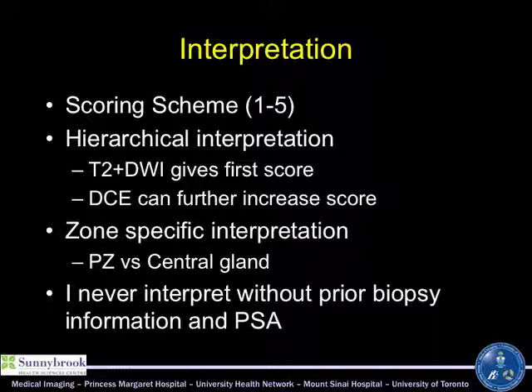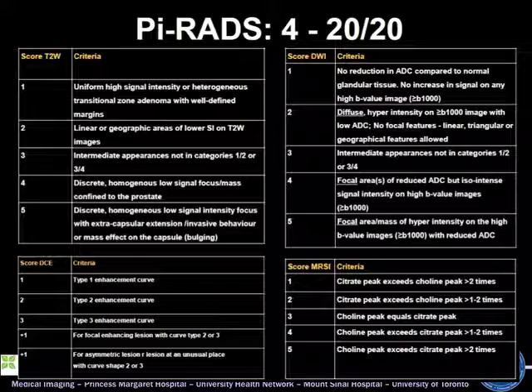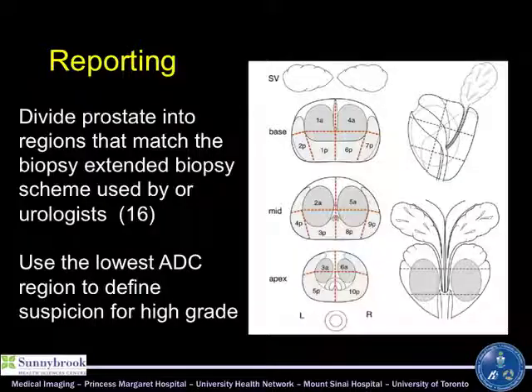We really like to get the prior biopsy results from you, and so I think this has been an issue with the referrals in terms of, rule out prostate cancer. It's not enough. I mean, I can do the interpretation, but it's really hampering me in terms of giving you the specificity you want. So we really like to have a copy of the prior biopsy report, whether there's a history of prostatitis, what the clinical scenario is, and so on. The current scheme being proposed, the PI-RADS scheme, is too complex. We're working on paring this down with consensus groups.